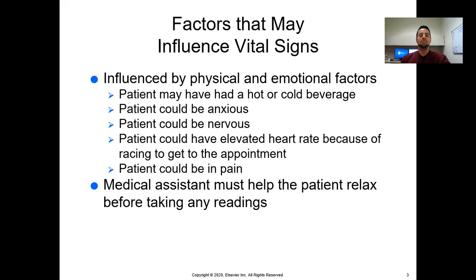Okay. During the time, your patients are going to be rushing late to their visits. So you want to just ensure that the patient takes a seat and relaxes as best to their abilities. And these patients usually know who they are when their blood pressure is raised because of their nervousness inside the office.